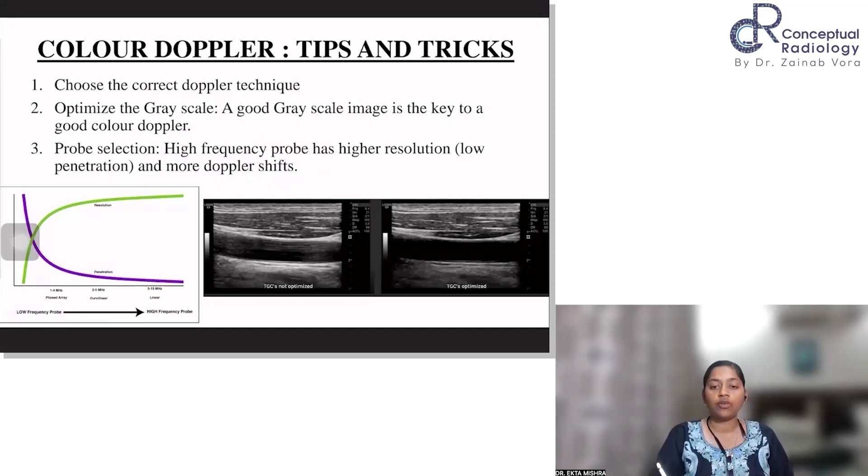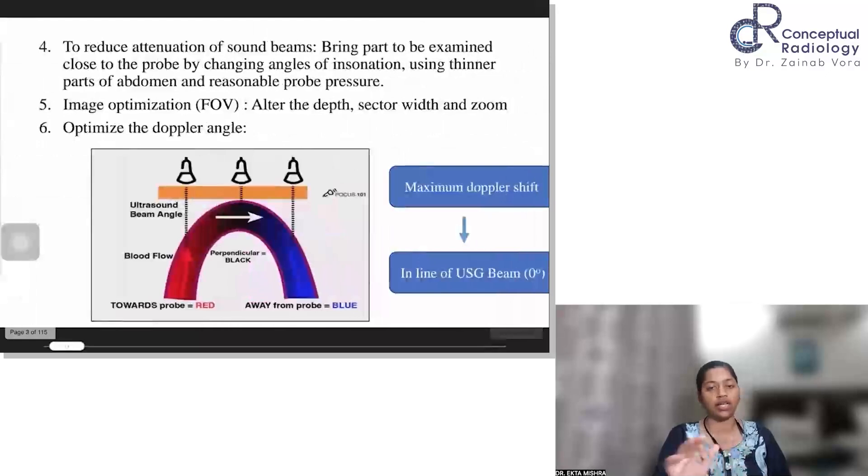So if your grayscale image is not optimized, you will get these shades. Your TGC is not optimized. But when you optimize it, you get a good grayscale image. And once you acquire a good grayscale image, you have confidence in the anatomy of that structure. And after that, putting color and spectral Doppler will give you a better result. So remember to optimize your grayscale image first.